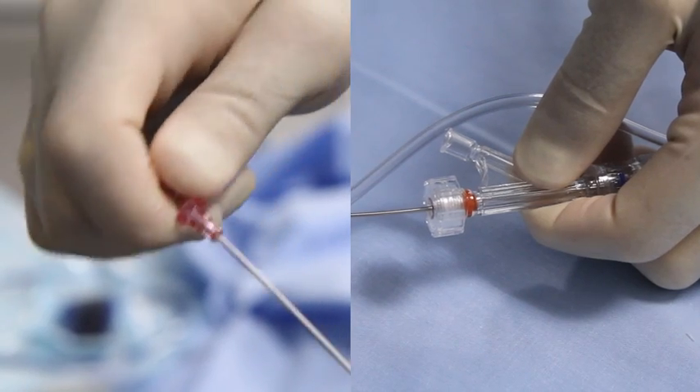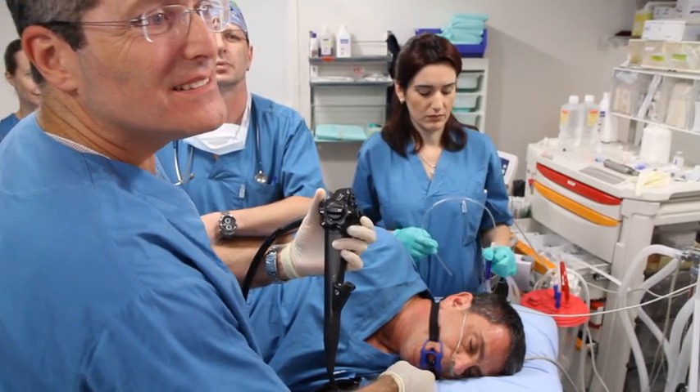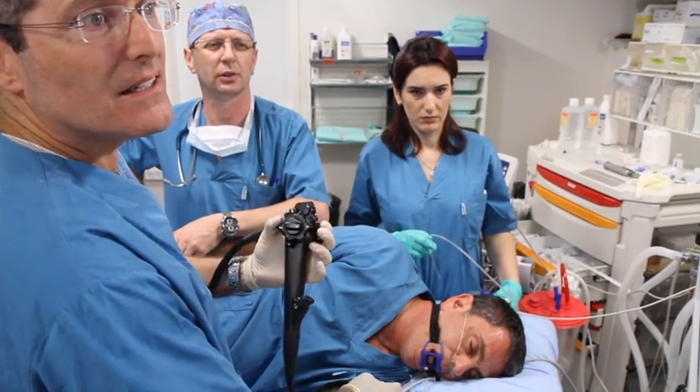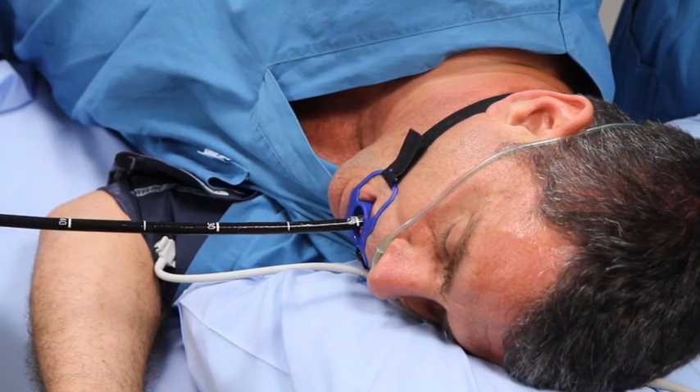Twirl the guide wire while holding the Y port. Prior to implantation, a standard endoscopy is performed to evaluate for contraindications and to identify the level of the gastroesophageal junction.